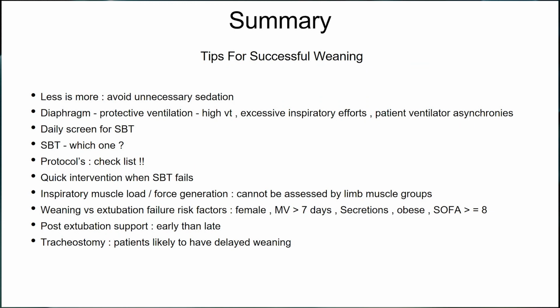So just to summarize, avoid unnecessary sedation. That is the key. Until and unless you wake them up, you will never know whether your patients are going to tolerate or are ready for weaning or not. Make sure that your ventilatory strategies focus on protecting the diaphragm, avoid excessive tidal volumes, excessive pressures. Daily screening for SBT is a must. Well, which SBT do you want to choose? I personally choose a pressure support based. We don't use T-piece trials. So that is something that you can look at in your own ICUs.